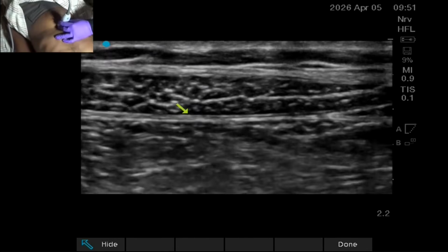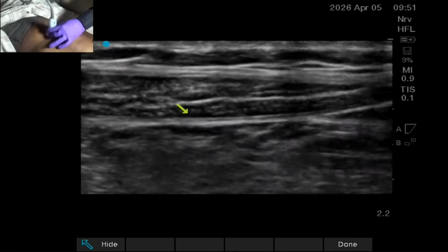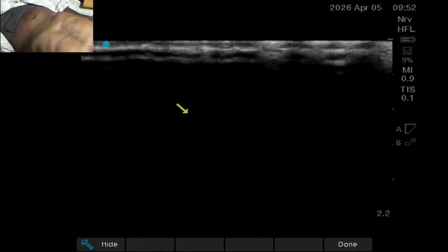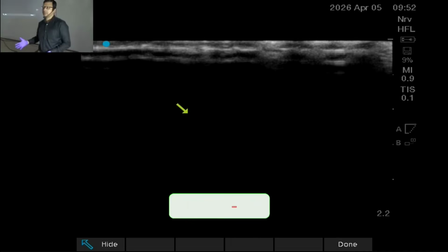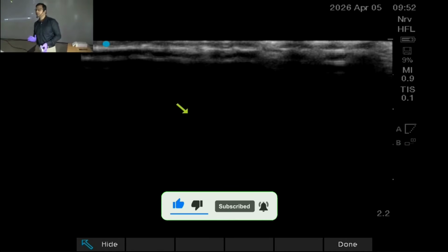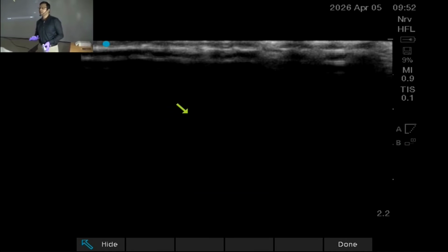One disadvantage with abdominal wall blocks especially is that when we are doing a plexus block or nerve blocks, we usually have fixed anatomical landmarks like bone or artery. Even in chest wall blocks you have the thoracic cage. But here we have to depend mainly on muscles and the fascial planes. In most cases we are not directly seeing the nerves, so correct plane identification is very, very important.